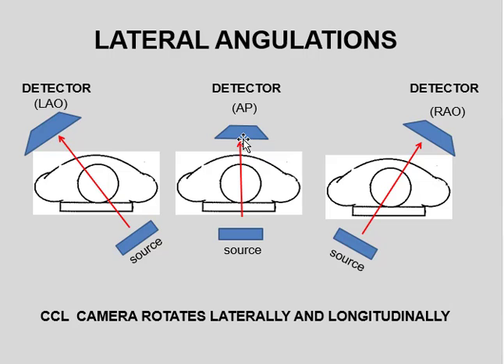The X-ray machine, the gantry, rotates around the patient so that the detector and the source stay aligned, whether the gantry moves to the left or to the right of the patient. When you move to the patient's right side, it's called the RAO, right anterior oblique view.